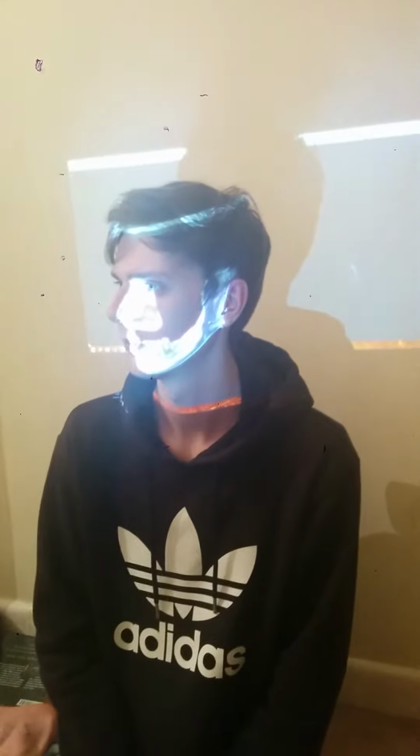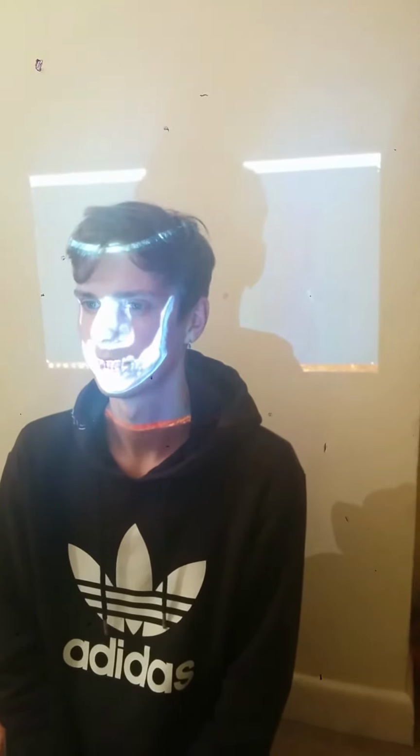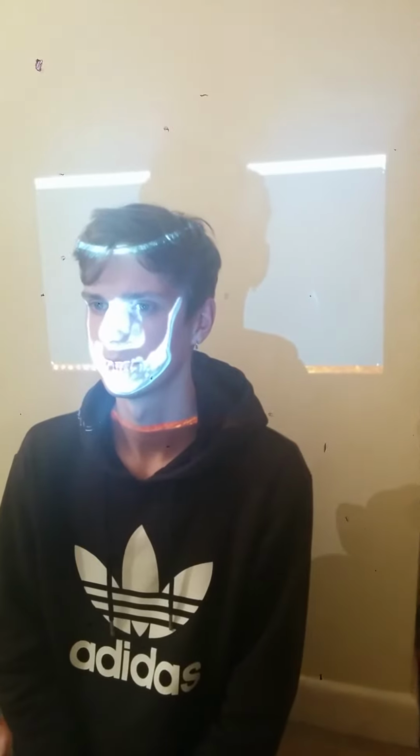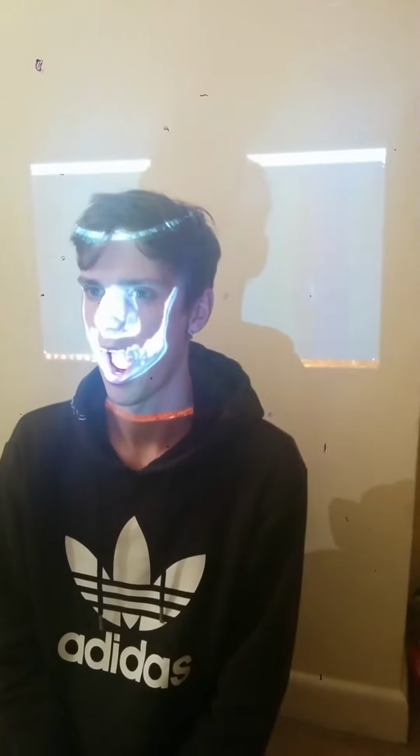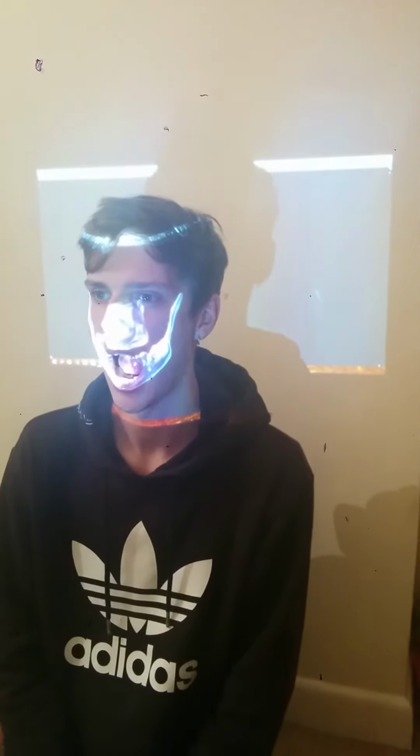For instance, if the patient now faces forward, okay, there are certain situations where this would not work, and that is when the patient opens his mouth very wide, as the Kinect interprets this as him rotating his head forward slightly.